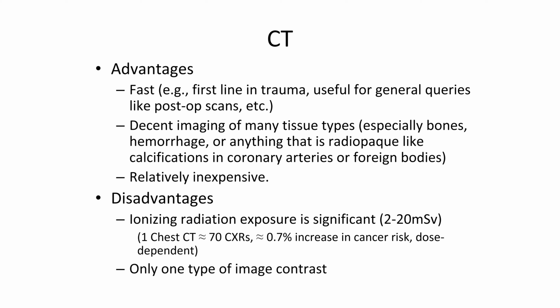So the more CT scans you have, your risk rises significantly, even to the point where it can be in the range of the Hiroshima survivors who, they studied a large group of them that were exposed to about 50 millisieverts. I think there was like 25,000 people in that group. So if you have a whole body CT scan that's about 20 millisieverts, then you can basically end up with a similar dose of radiation to being in the perimeter of an atomic bomb explosion.